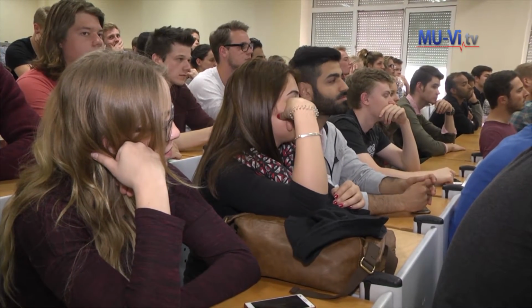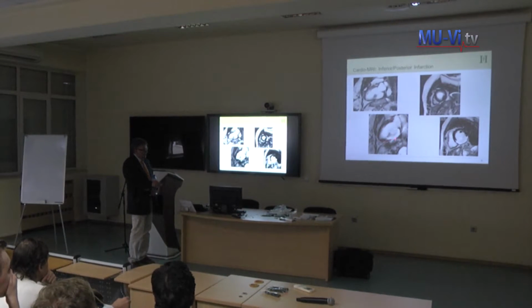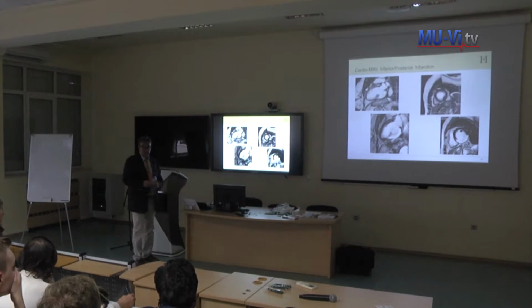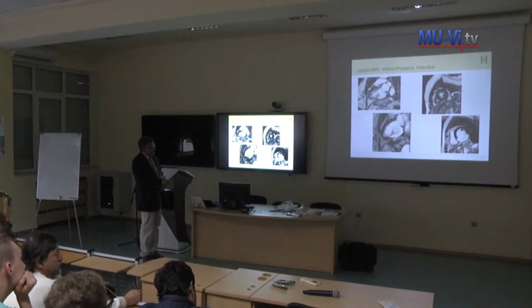Do you see that? The corresponding late enhancement, that is the sequence where we can see scars, is here. The black is intact muscle, and the white is scar. Yeah? And you see with this disturbed movement, the corresponding scar at this side.